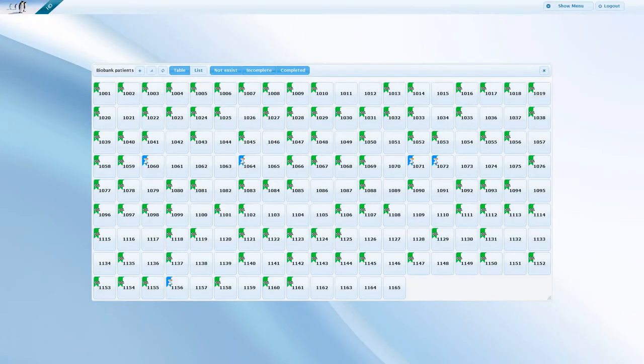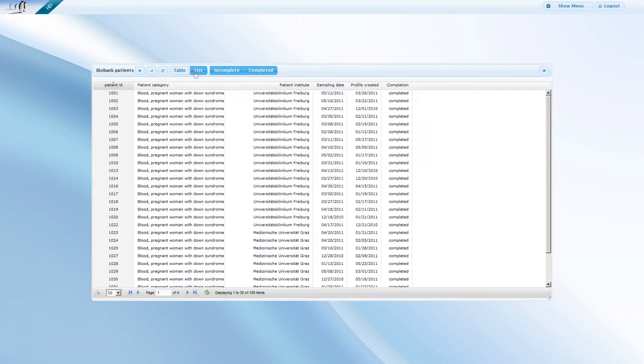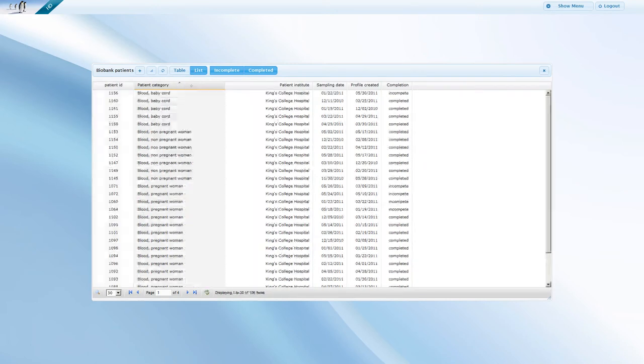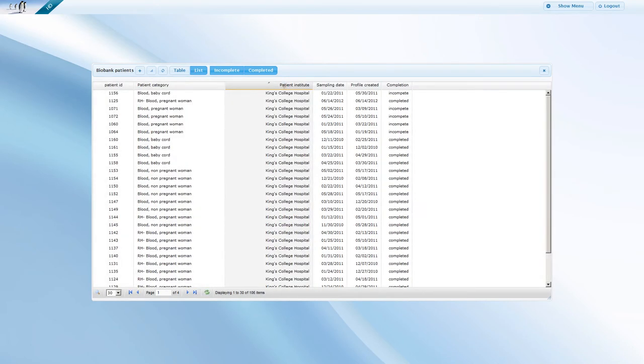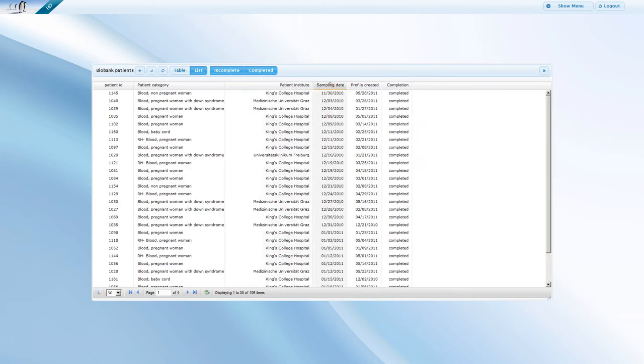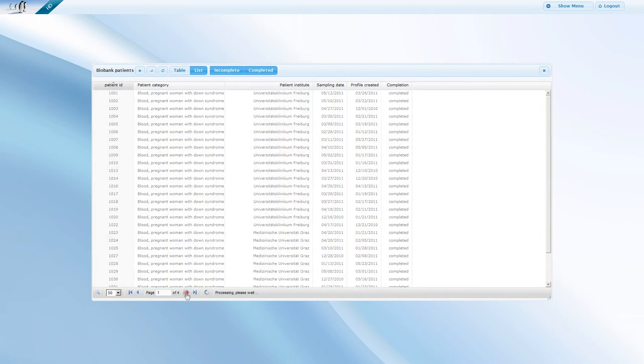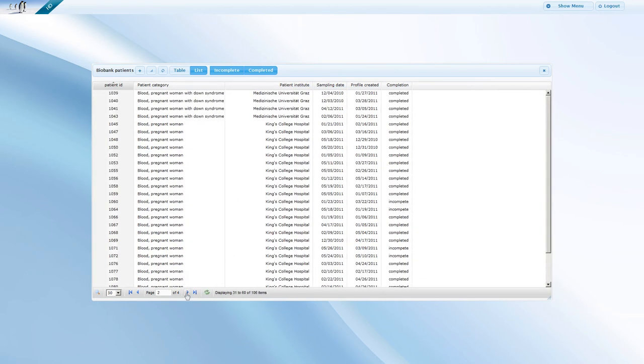Apart from the table view that you have just seen so far, patients can also be displayed in the list view for your convenience. The list view might be more manageable if there are a large number of patients.